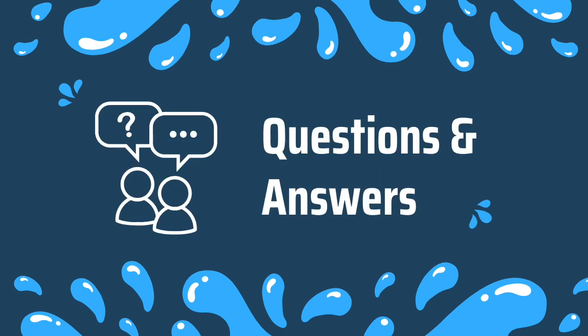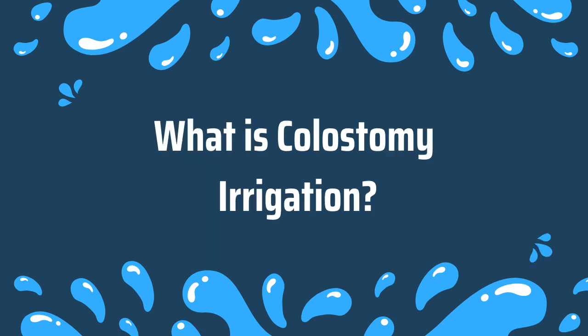Now let's get started with some questions and answers with Joy Hooper. What is colostomy irrigation? Well, colostomy irrigation involves the installation of lukewarm tap water into the stoma. And this installation of water stimulates peristalsis or contractions of the colon, leading to the elimination of their stool, or what's referred to as their return. Colostomy irrigation is a well-established option that's used by some individuals with a descending or sigmoid colostomy to regulate and manage their output.